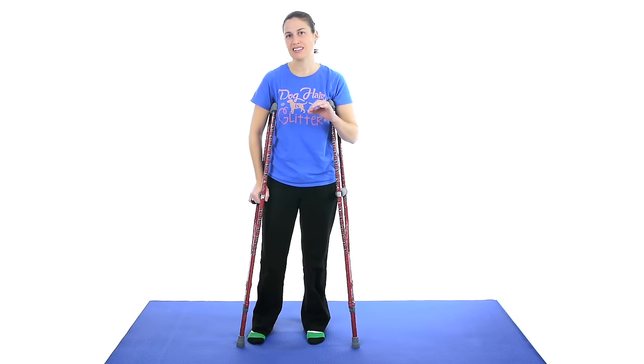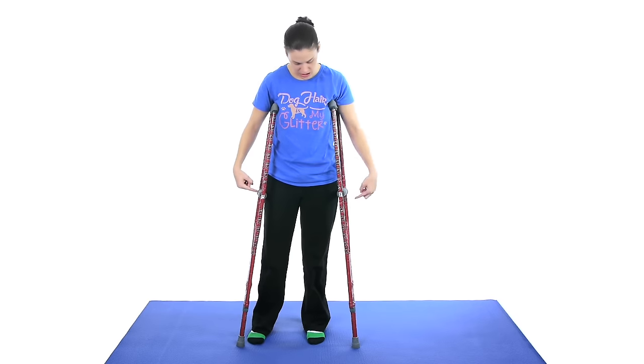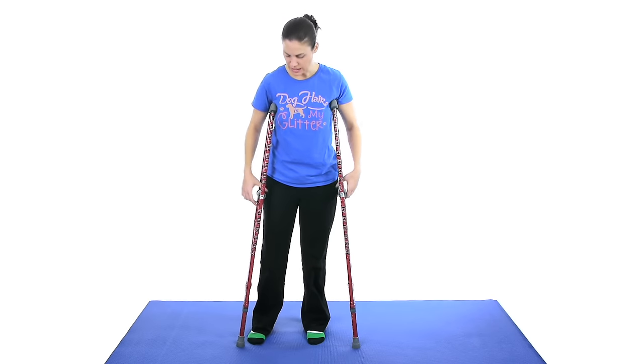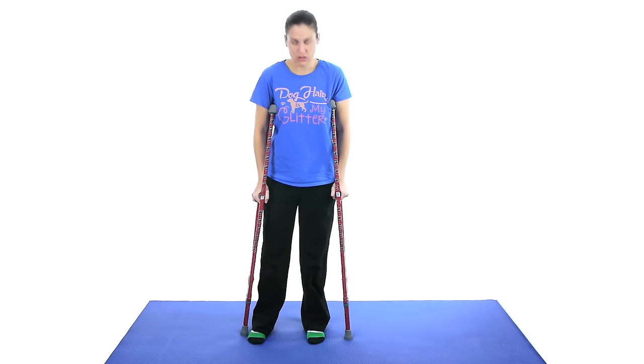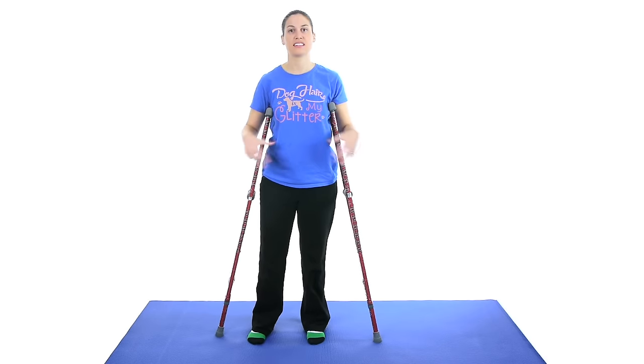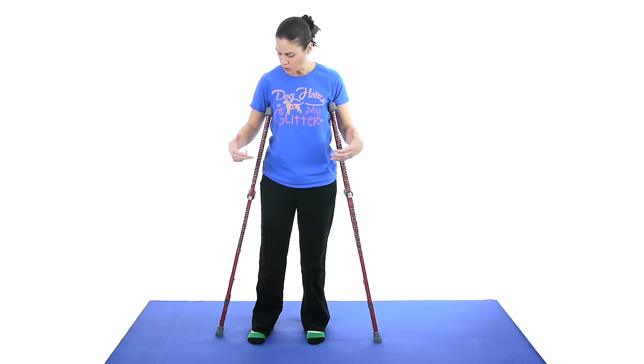You want to have just a slight bend in your elbows as well because you can move the handles, but it doesn't have to be a big bend, just a slight bend. Because when you're walking with the crutches, you don't want them super close, you want them out to the side just a little bit because that's going to give you some more stability while you're walking.